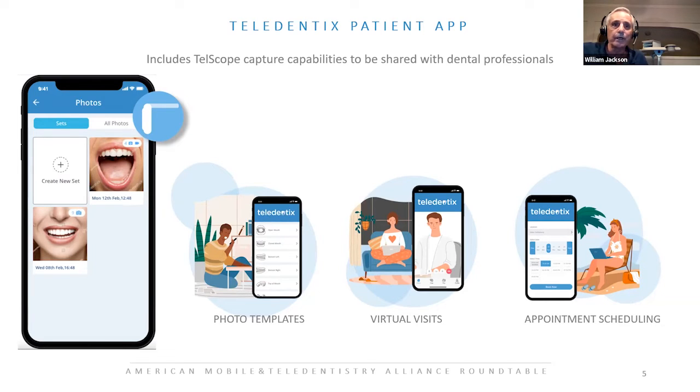And again, then you can share that. It becomes part of your patient record, and it goes into the patient portal. The patient then has access to that too, and anything else that you did. If you did a prescription, if you wanted the patient to see other educational materials and so forth. And we actually even allow the patient to do selfies if they want to at home.